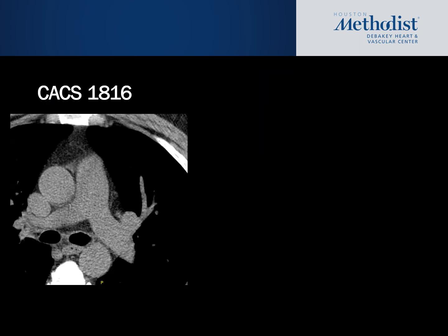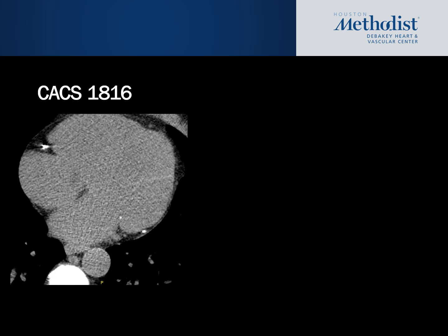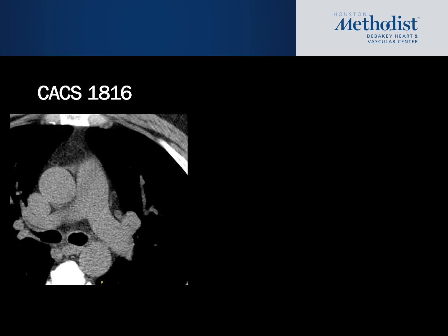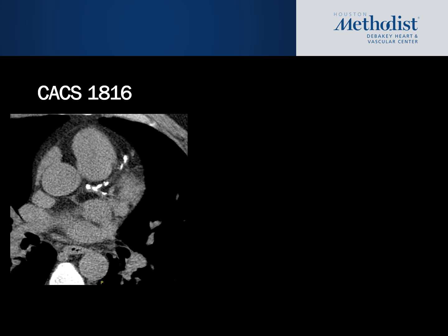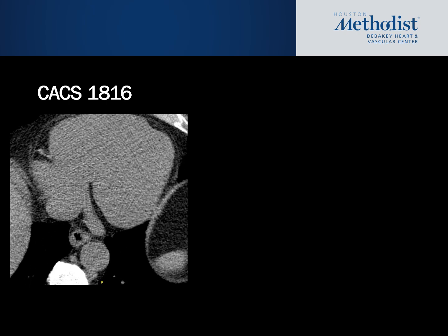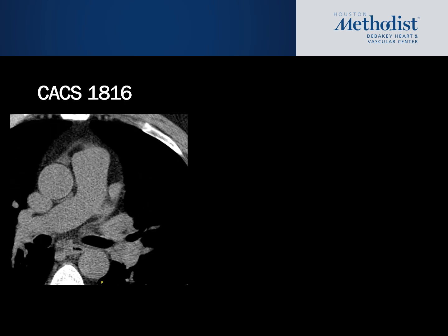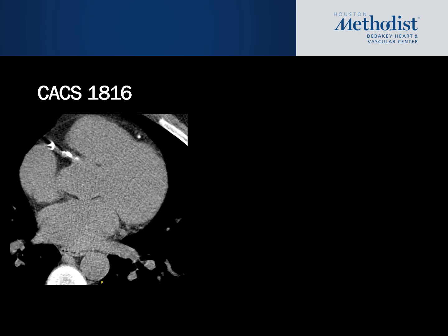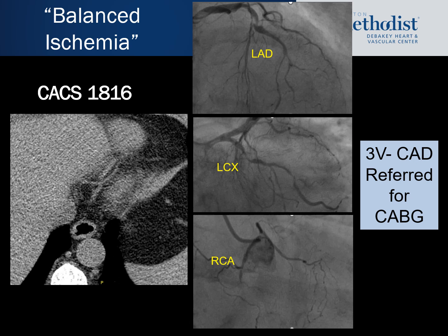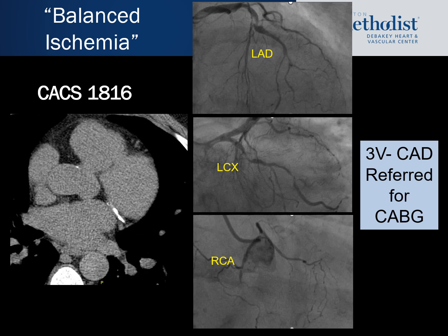In addition, when the patient underwent a coronary artery calcium score, you can see the arteries were chock full of calcium, and here the score was actually quantitated to 1800. So we felt very uncomfortable calling this study normal with the EKG changes, the chest pain with exercise, plus the evidence of severe atherosclerosis within the coronary arteries. We pushed for further imaging with a coronary angiogram, and sure enough, the patient had triple vessel disease, and the nuclear perfusion images were a false negative, most likely due to balanced ischemia.